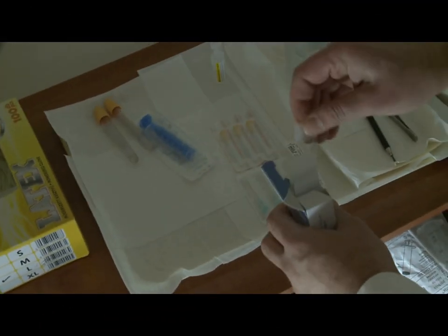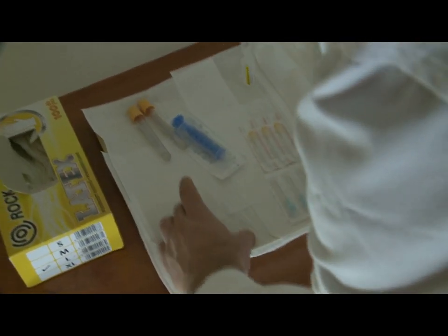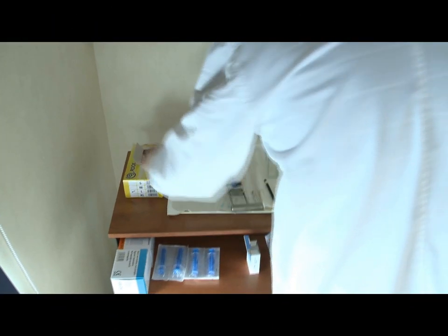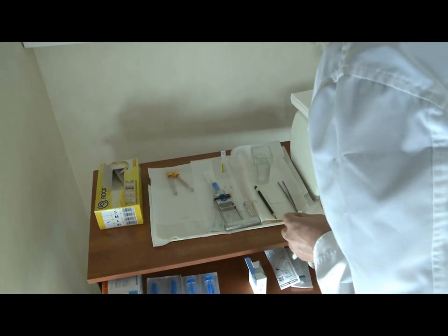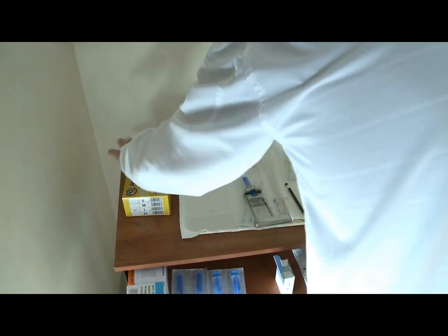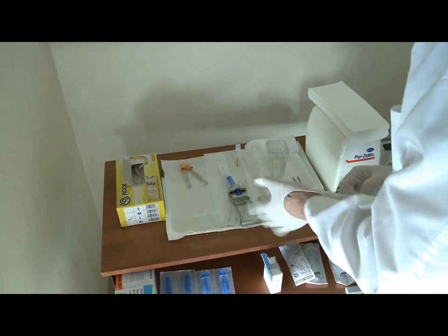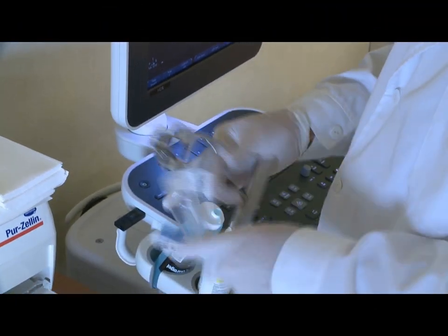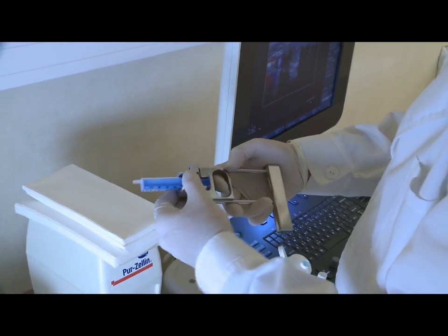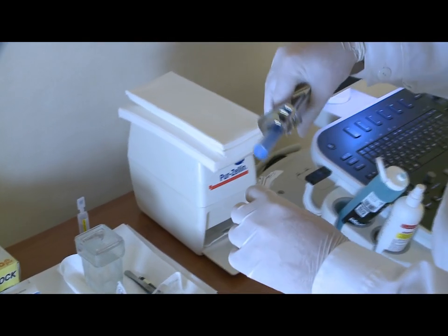The first and very important rule is the signing of the slide. For safety, I suggest this be done by the person who is also doing the sampling. I don't think that ultrasound guided aspiration requires the involvement of another person — this is a one-man or one-woman job. Now I put on gloves. It is important to insert the correct side of the syringe into the pistol, which will ensure the needle fits into the ultrasound probe during aspiration. Now we insert the appropriate needle to the syringe.